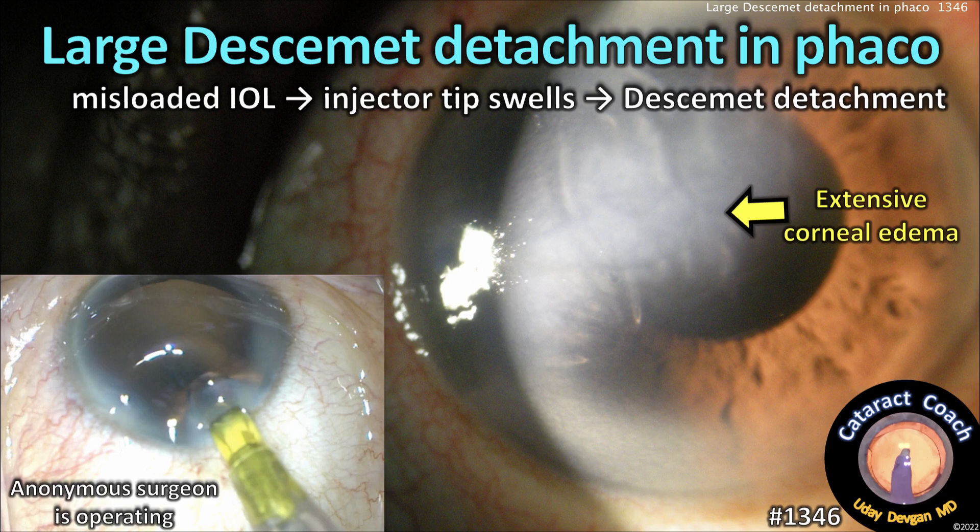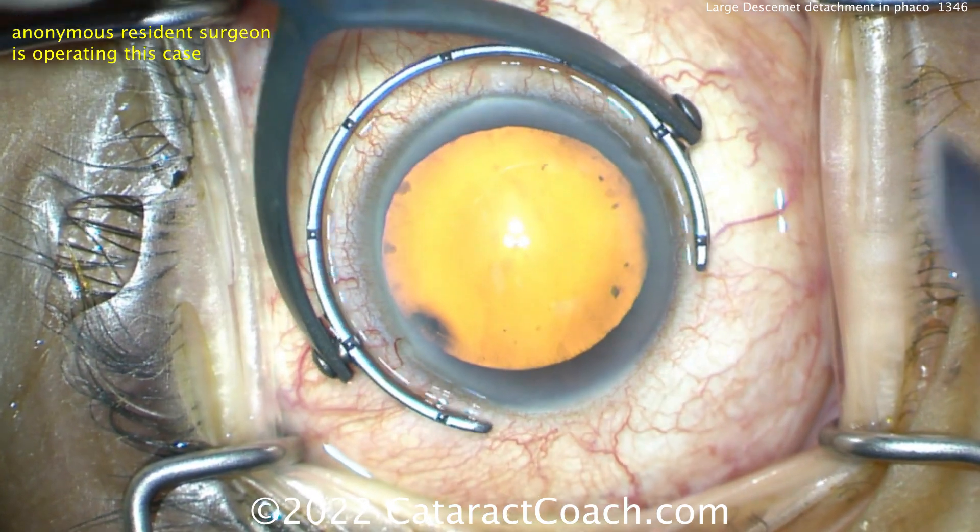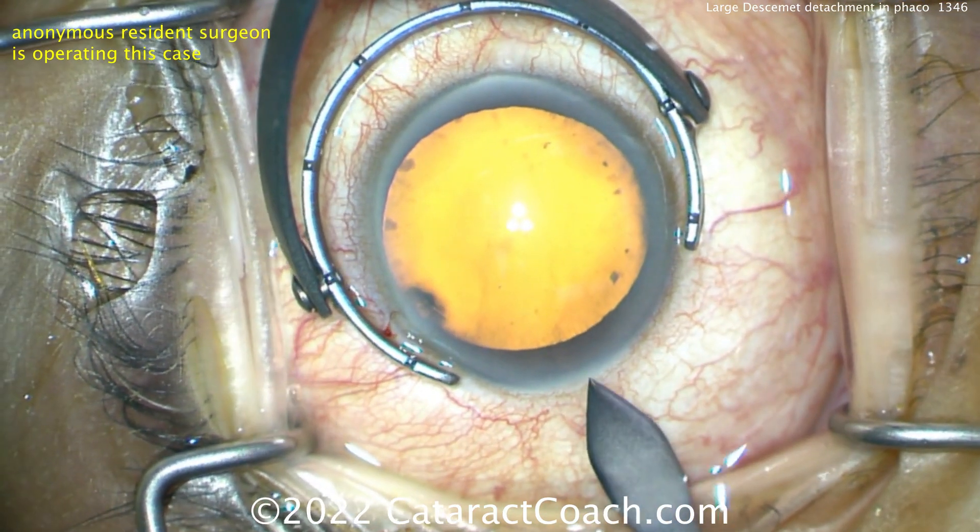CataractCoach.com. Large Descemet's detachment in phaco. A misloaded lens caused the injector tip to swell, it was shoved in the incision, and you get a huge Descemet's detachment. Let me show you the case here.